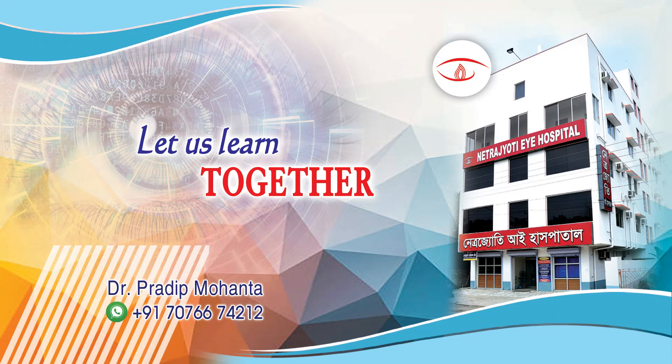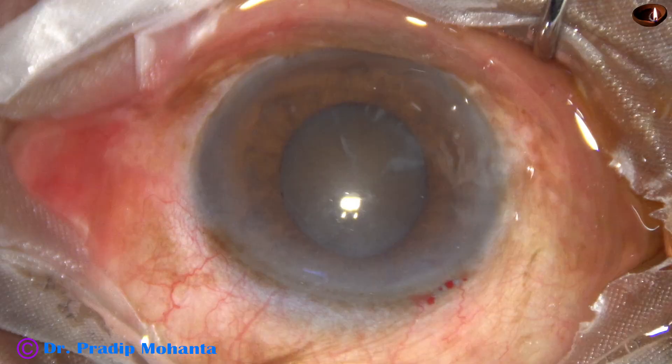Dear colleagues, welcome to my workplace at Ranagha to Spengal, India. Let us watch the management of this hard cataract with small pupil in this video.